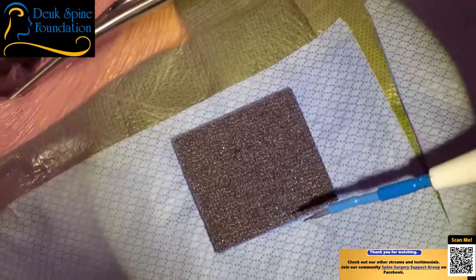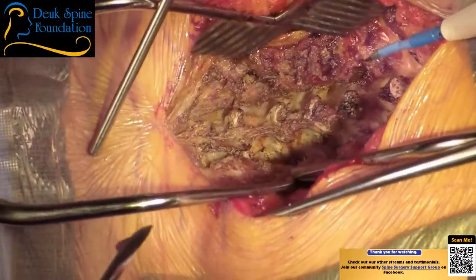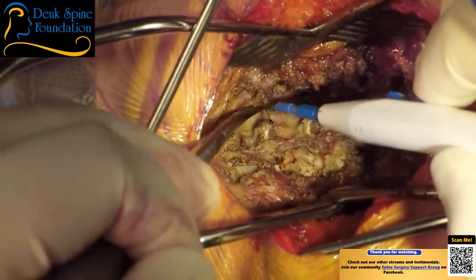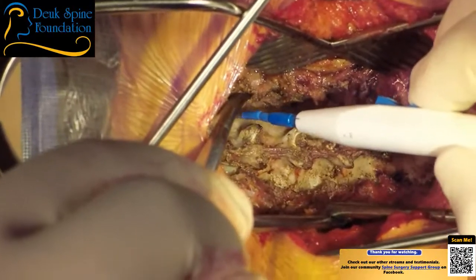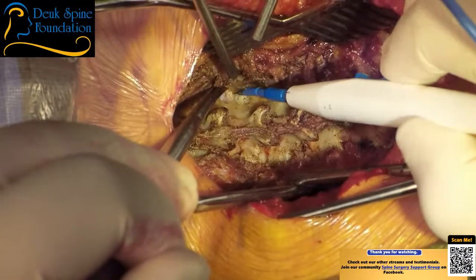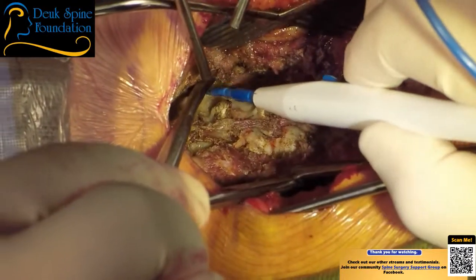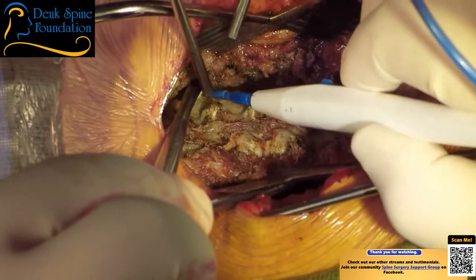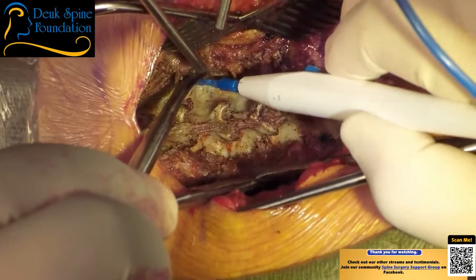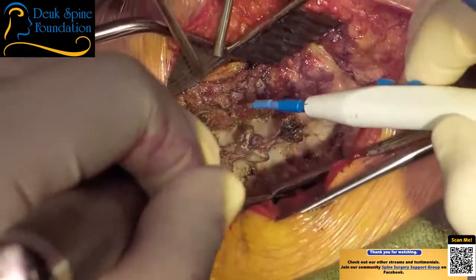So no, we're not going to use a transitional rod. We're going to use just a rod that has one diameter, consistent throughout. All right, so we're making progress here. Again, you want to be careful not to plunge. I'm getting out to the lateral mass. I'm past the spinolaminar line. I can see the facet joints. The facet joints are very mobile.